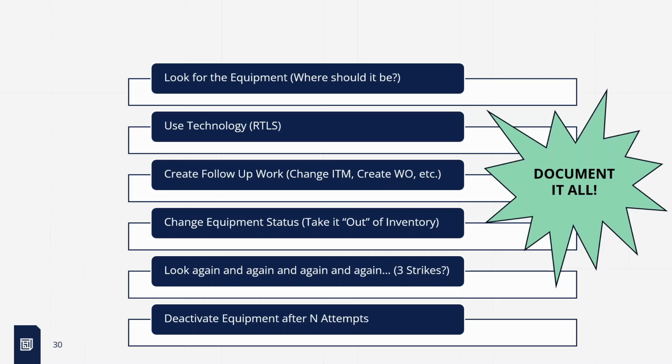Well, you have similar things on the same floor, and people call them different things. Somebody will put defibrillator dash something, and somebody will put the thing in front of the defibrillator. Or for a med gas valve, somebody will put med gas shutoff, somebody will put med gas valve. So you do have to have some type of naming convention and category convention for doing those things.